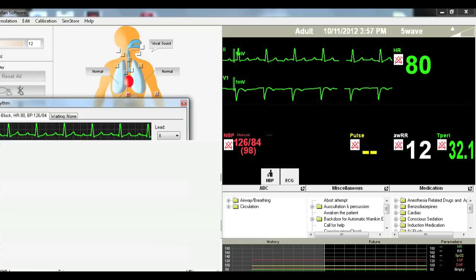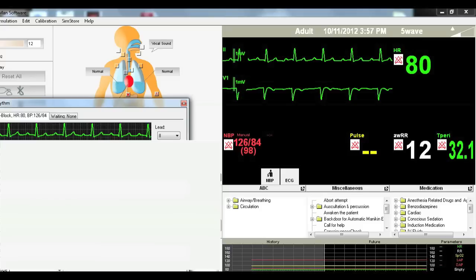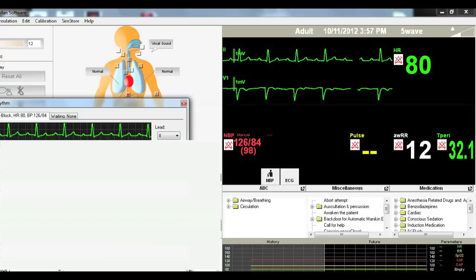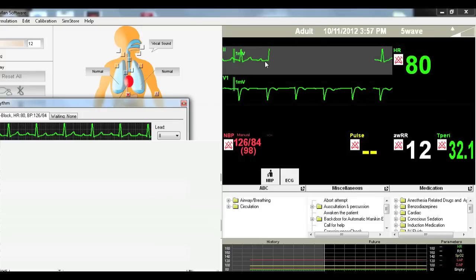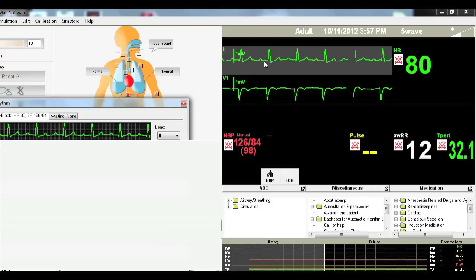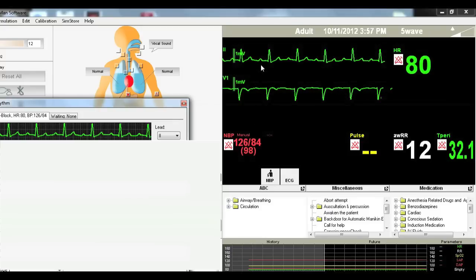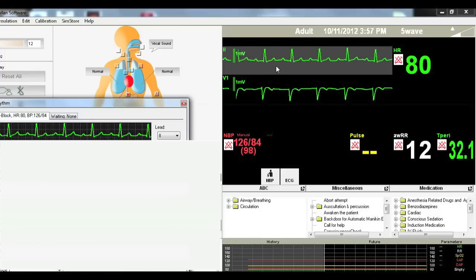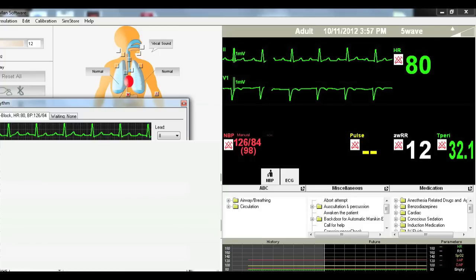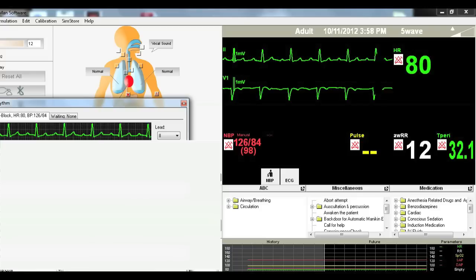So this is actually one of the ones I was talking about that is kind of hard to diagnose through this situation. This is a first degree AV block. This is diagnosed by having a PR interval, so here is your P wave, here is your R wave or QRS. P to R interval is greater than 0.2 seconds. That is a first degree AV block. Moving on here.